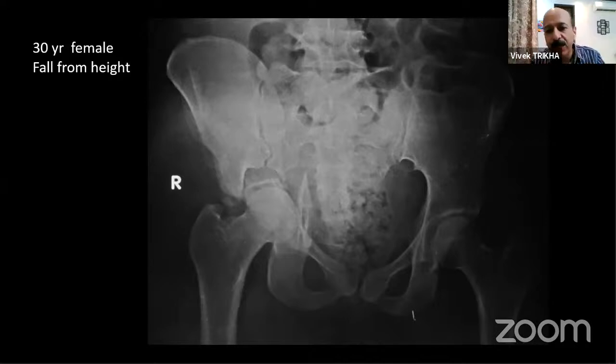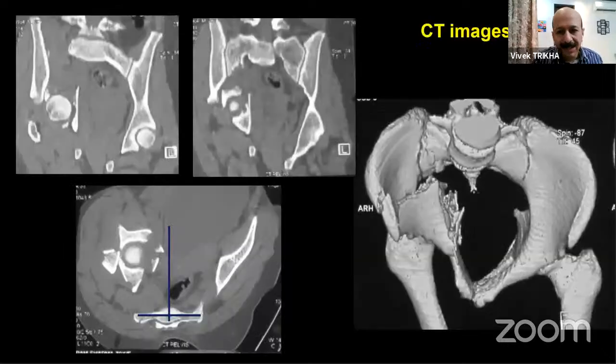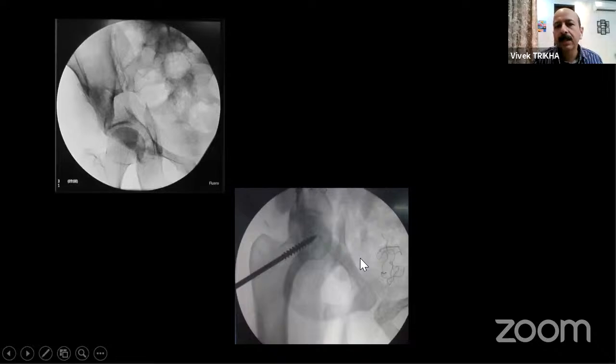And I'm showing you complex fractures now, how widely displaced fractures can be fixed with the lateral window and Stoppa approach. Imagine and see the amount of displacement this fracture has. How medialized that fracture is, the entire hip joint has gone medialized. The primary stable fragment is lying here and the entire hip joint is inside. So again, you reduce it, with traction or a lateral pin.